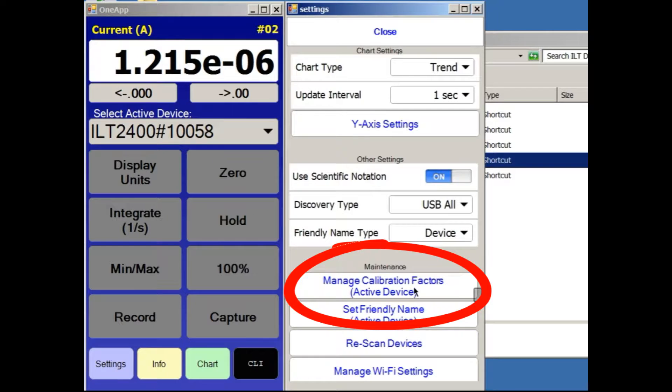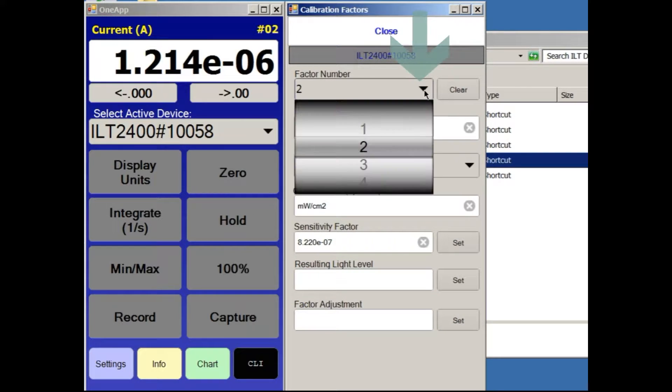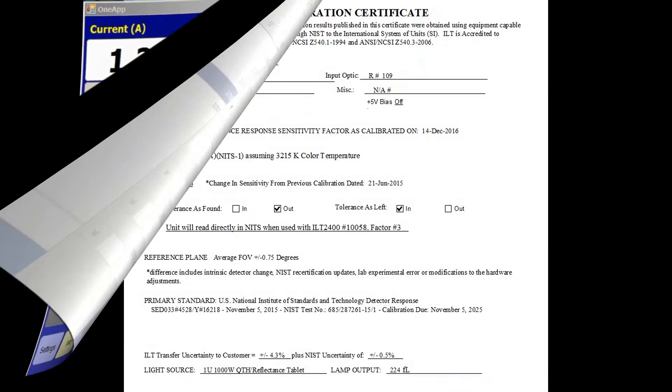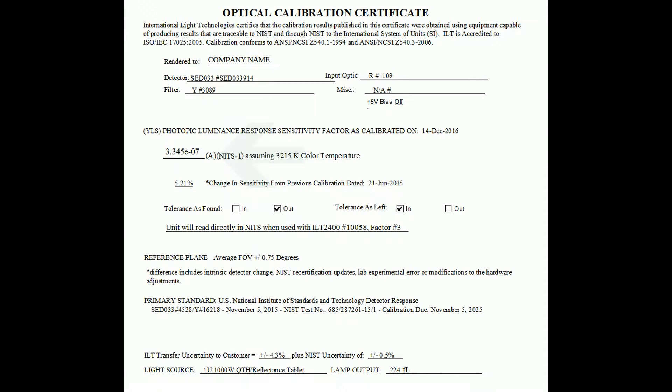Use the factor number scroll bar to select the next empty factor number slot, in this example Factor 3. Then, locate the calibration factor from the calibration certificate.